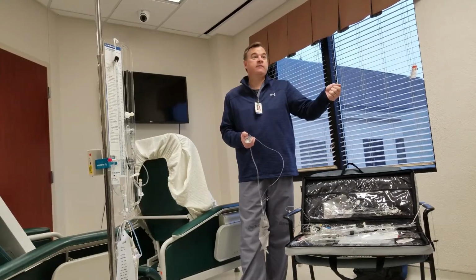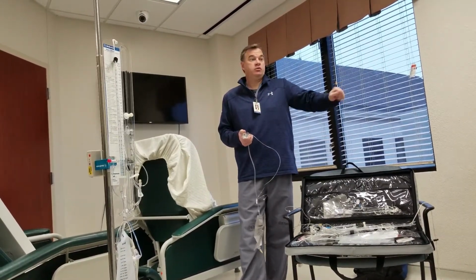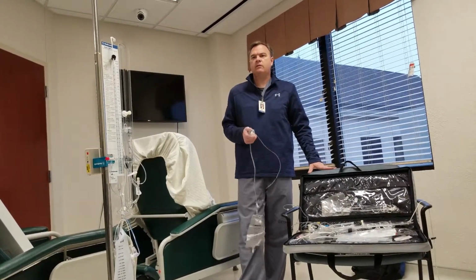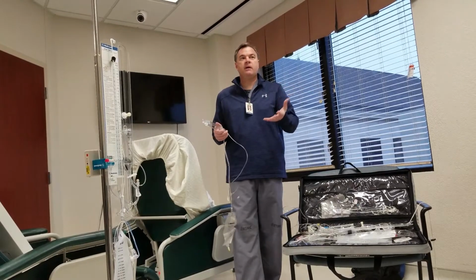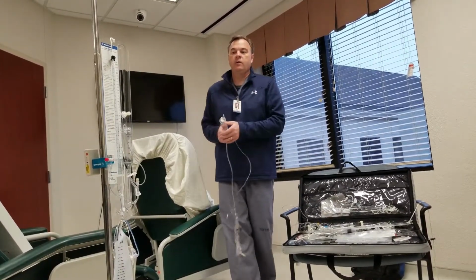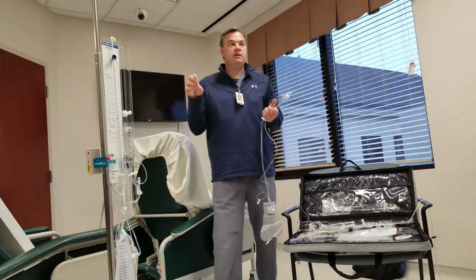If you drain off 60 or 30 or whatever on the first part of your 8-hour shift, and you just turn it off and think, good, I got my 30, this is now the night shift's problem, well, what happens the other 6 hours? There's pressure building up, and now that patch is under significantly more pressure. So a lot of times people like this because it's just a pressure release valve.